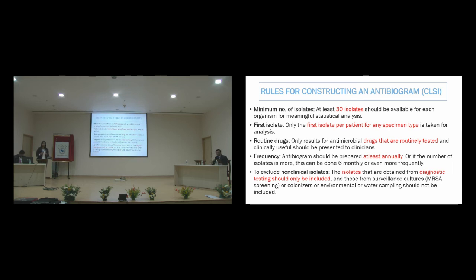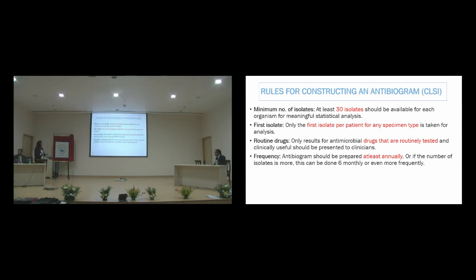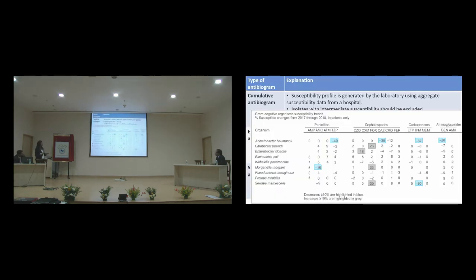May I add something? Can you just go back to your previous antibiogram? Yeah. So this is one antibiogram, and the one that you showed earlier, I will talk about the cosmetic appearance of the antibiogram. In the previous one, you did not club together the penicillin groups or similar groups. So on one axis you club together all the drug groups, and on the other side you club the families together, like Enterobacteriaceae, and that looks better. Yeah. Like over here, it is arranged alphabetically, Acinetobacter, Citrobacter, and so on. If you arrange it as per family, that gives you a better presentation.